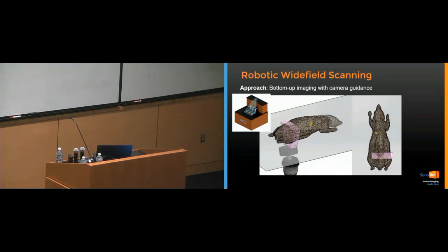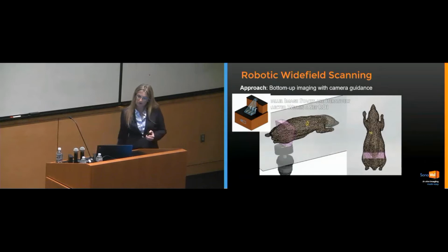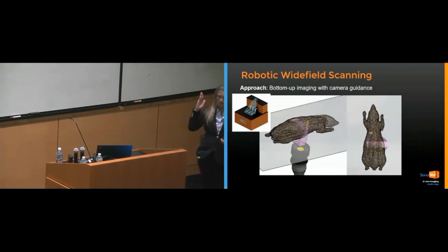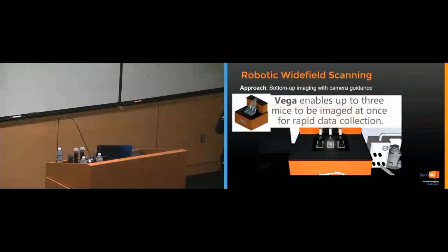Let's say you want to do the whole body cavity of the mouse, then you take a slightly larger ROI. And then, the transducer is underneath the acoustic membrane, the mouse is on the acoustic membrane, and based on the settings of your ROI, your scanner will take these parallel images that are iteratively collected within a set ROI. So basically what happens is the transducer captures XY images along the axis of the mouse. And then we Z-stack them, and that's how we create a 3D volume. And then each mouse is imaged sequentially. So you could see number one is scanned, then number two, number three.